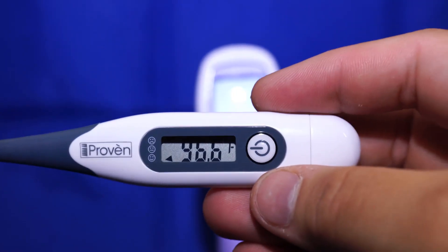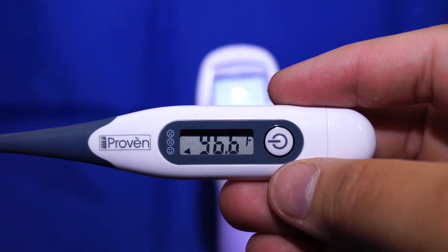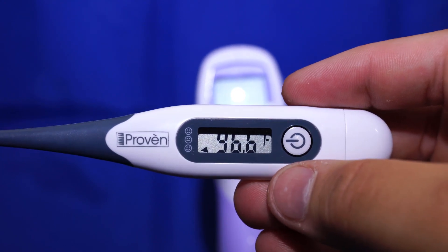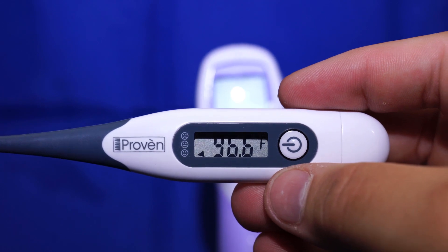Next, we want to compare that to our known temperature reading, which is 96.6, and find the difference between the two. Our difference right now is going to be one degree Fahrenheit.